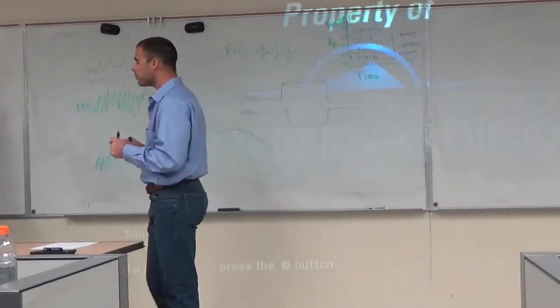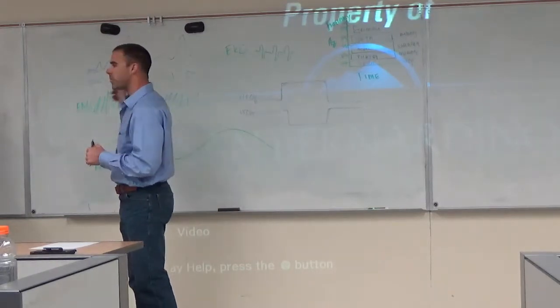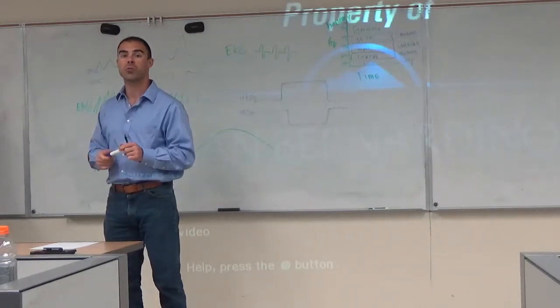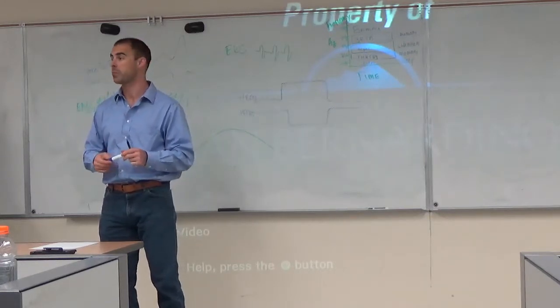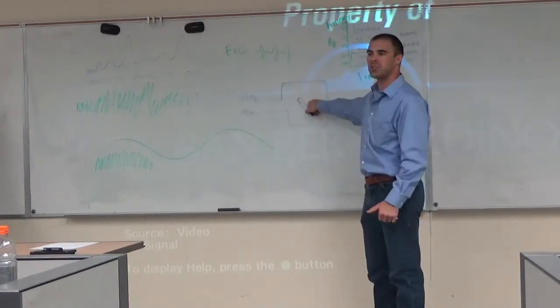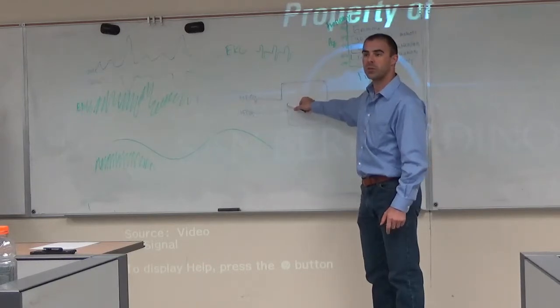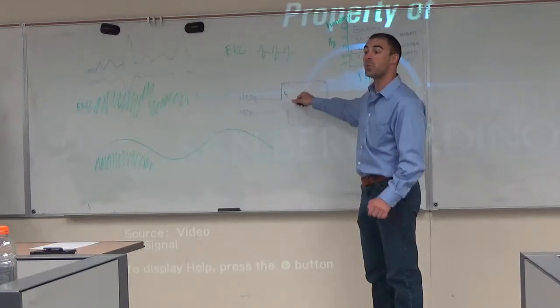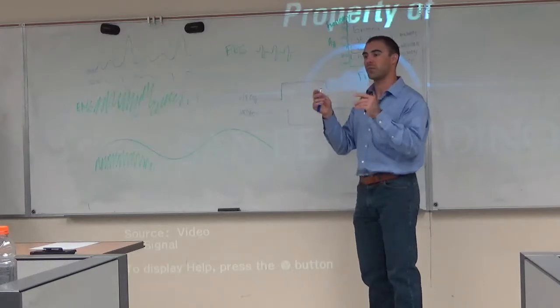The way that you could account for the eye blinks after the fact is to either reject the trials, you just say, nope, we're not including them, or two, we could correct the trials using something like ICA. So we'll talk about that a little bit more too. So let's move to the other eye activity. You can basically do the same, well, actually a little bit different preventatively, right? Yes, Kelsey, what could you do to account for it? Make the word big enough so that they don't have to... Or small enough, actually. Yeah, you want to make the word smaller so that they don't have to shift their eyes back and forth.